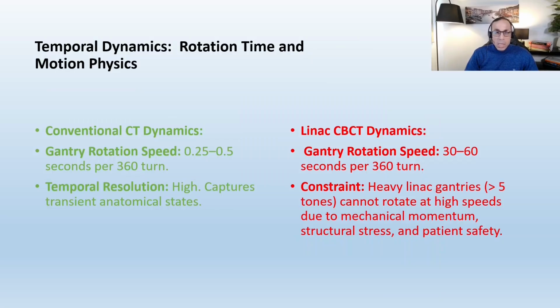Now it is time to talk about timing. CBCT image acquisition time is significantly higher than the fan beam diagnostic CT. So the parameter here is the temporal resolution, and it is another major point of divergence between conventional CT and CBCT of radiotherapy, I mean.